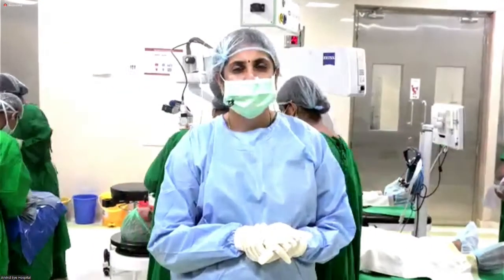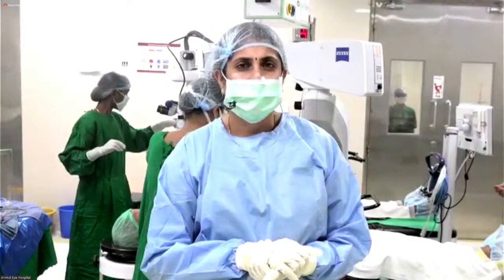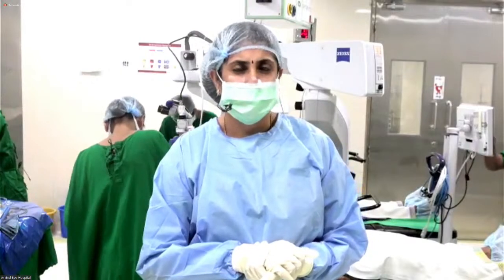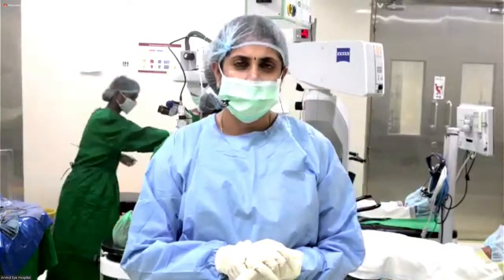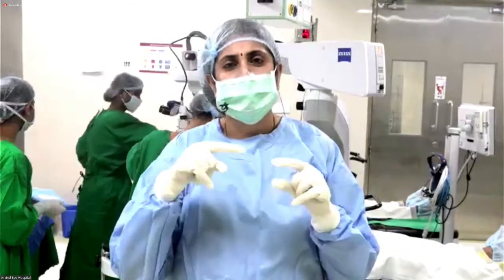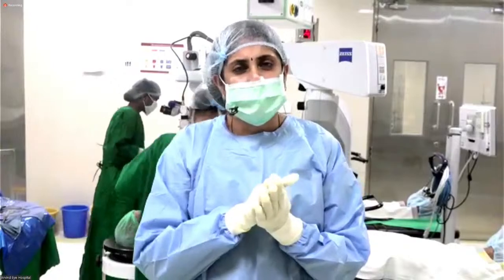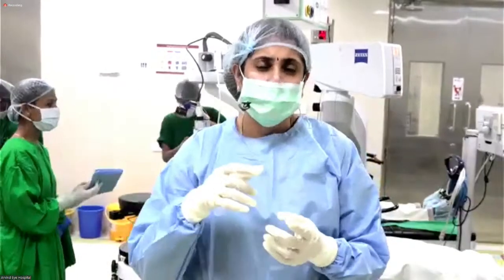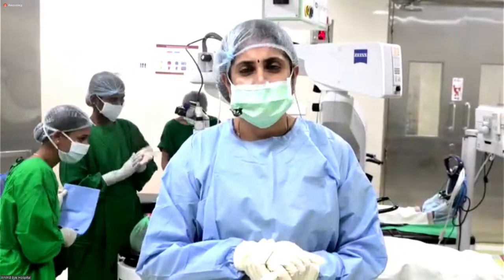For shooters, do you give any instruction to the assistant, like you should check whether it's moving smoothly? Sometimes there's a jerk. The only thing is, with the aspheric IOL, you may have an issue with the shooter if you've been using the shooter for a long time. The plunger in the injector may be slightly tilted upward, in which case it may go over the IOL optic and get stuck. When you press, you have to push with too much force, and this IOL may just rush out into the chamber, and you may have a rent or something.